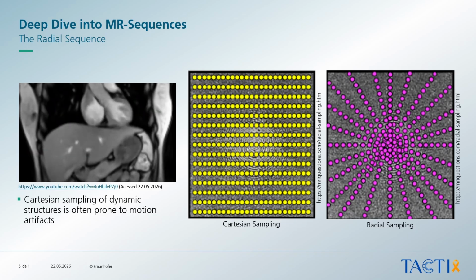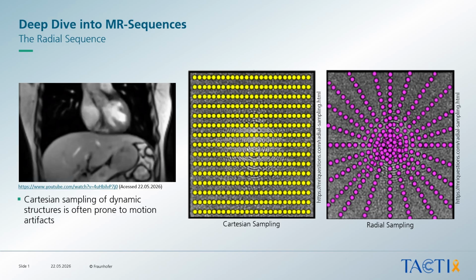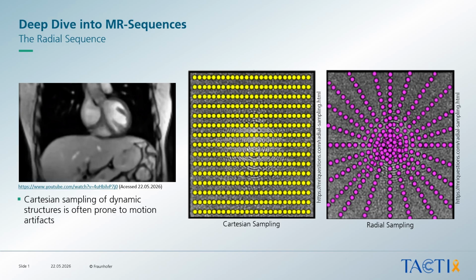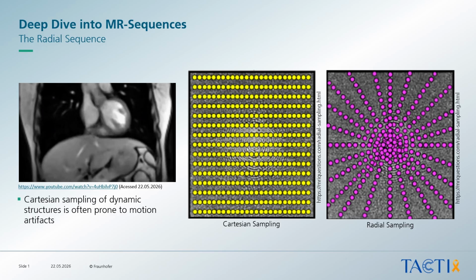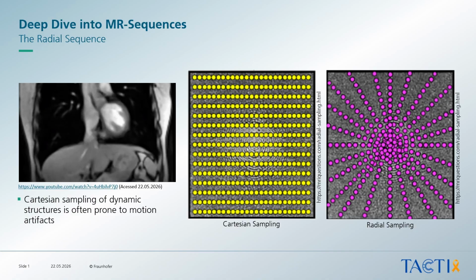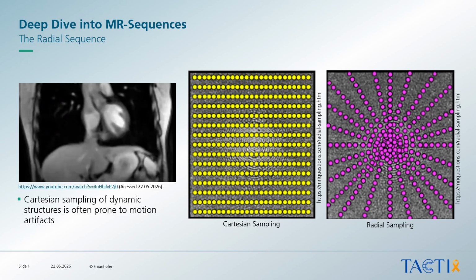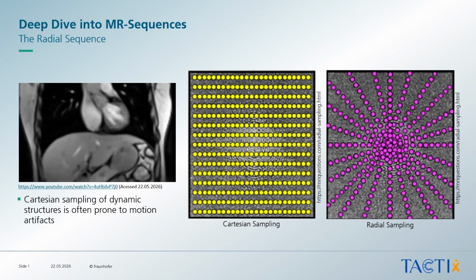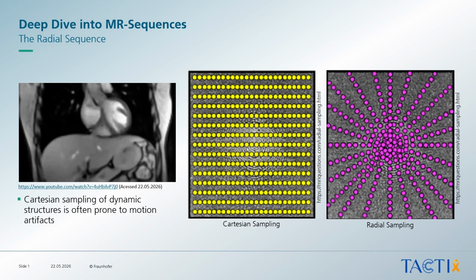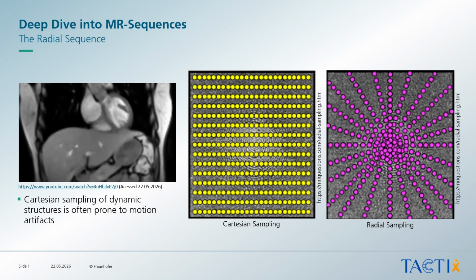So before we always looked at Cartesian sampling patterns where we acquired k-space in a line-by-line fashion. So for the radial sampling, we acquire k-space in form of so-called radial spokes. So we start in the center of k-space and then traverse to outside regions of k-space and sample the data. And we do that in the demonstrated radial sampling pattern on the right.